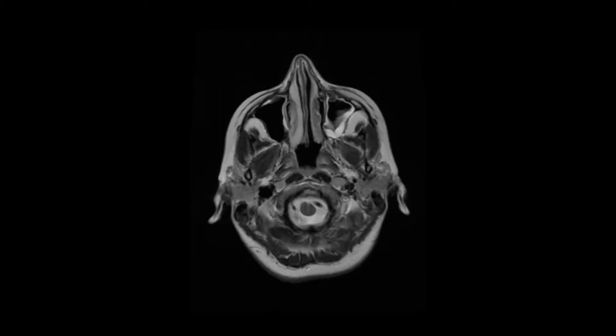If we come down a couple of slices even still, this represents the eventual emptying of CSF into the cisterna magna — the big CSF space at the level of the foramen magnum.